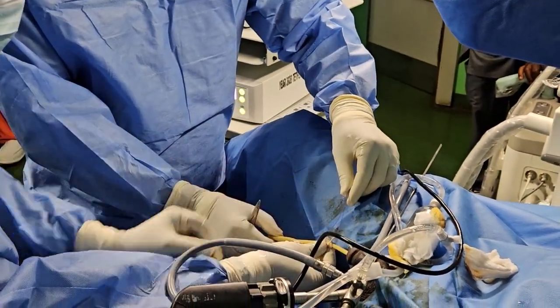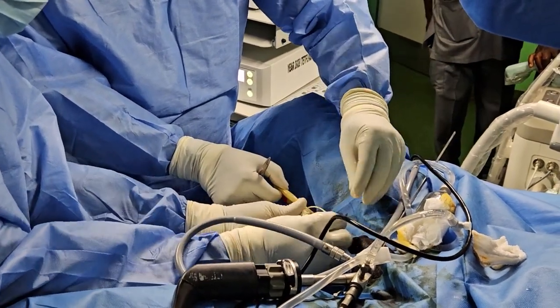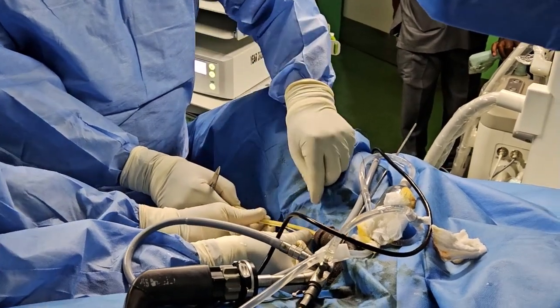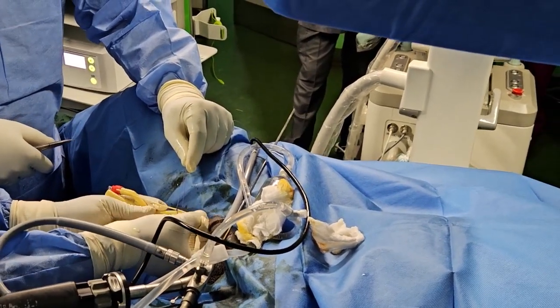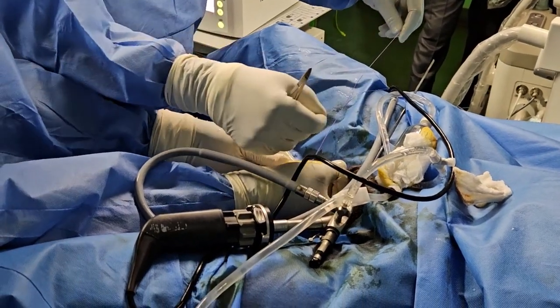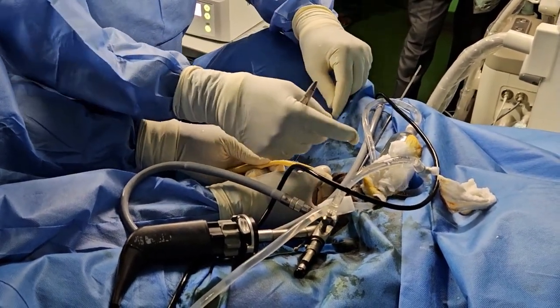Put on the hand now. Okay. Make them see what they do. Sorry, they are videoing. Put the two together. There. So he's using a suture. Dr. Lagwe, what suture are you using?